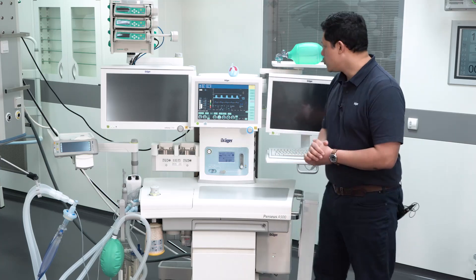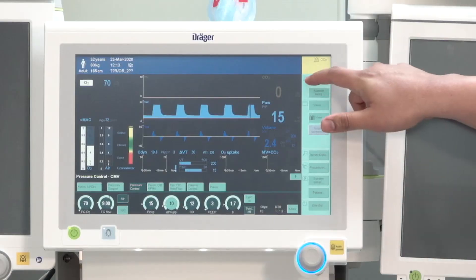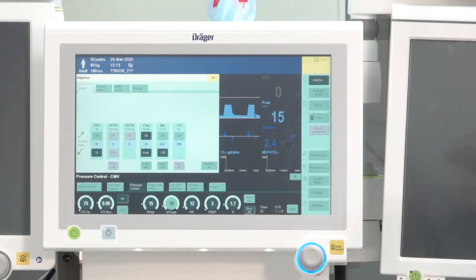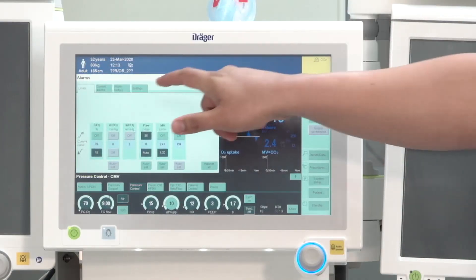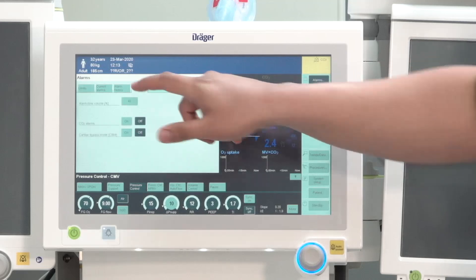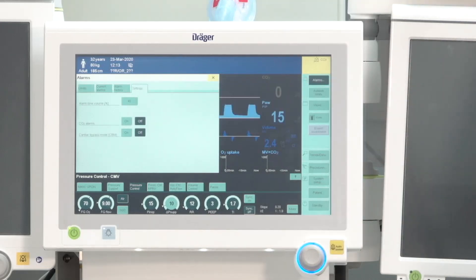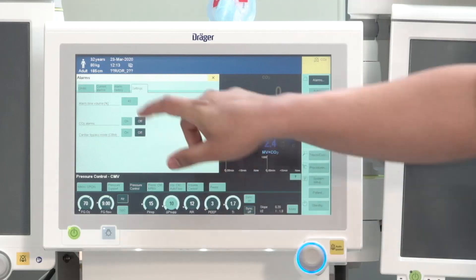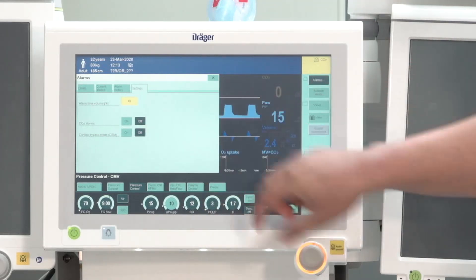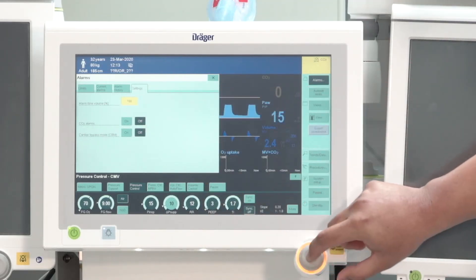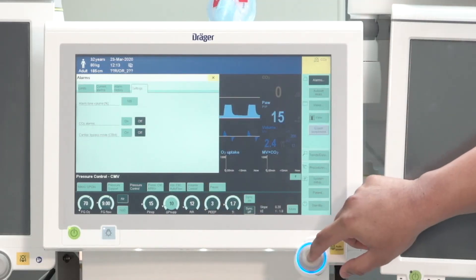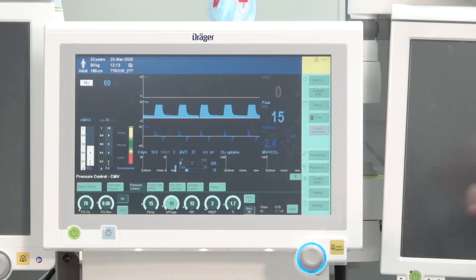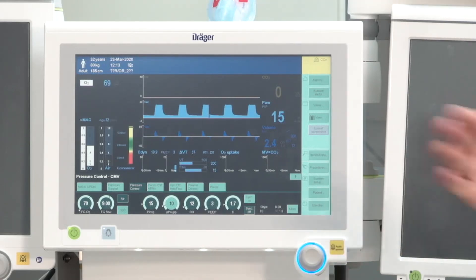To do so, press the alarm button, then go to the settings, and increase the volume to the maximum using the rotary knob. Don't forget to confirm using the rotary knob.